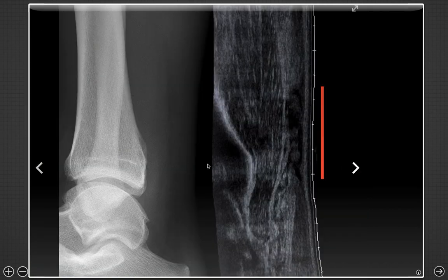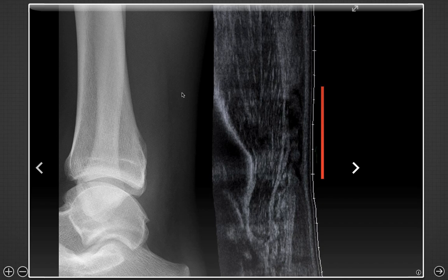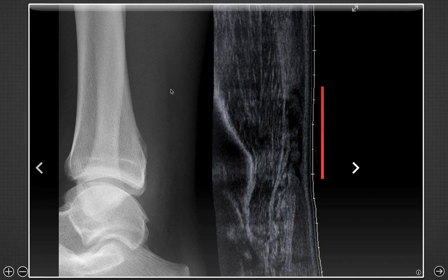Moving on to diagnosis — although you can assess this on physical exam, if it's completely torn it will be more evident. If it's partially torn, imaging like MRI and radiograph will give you a better idea. On the radiograph you can see soft tissue swelling — this area appears a little gray. You can make out the Achilles tendon going up, with an area of inflammation, and then a radiolucency, which is that dark area representing the remaining component of the Achilles tendon.